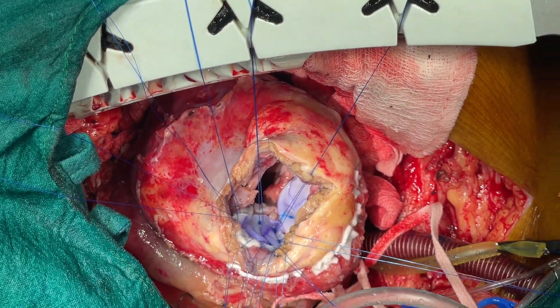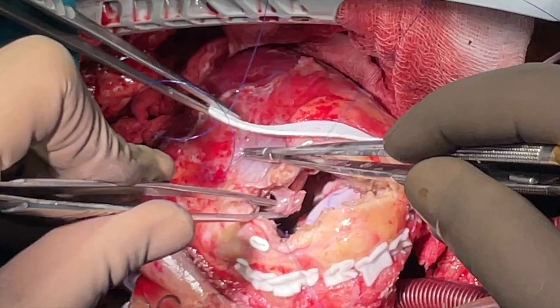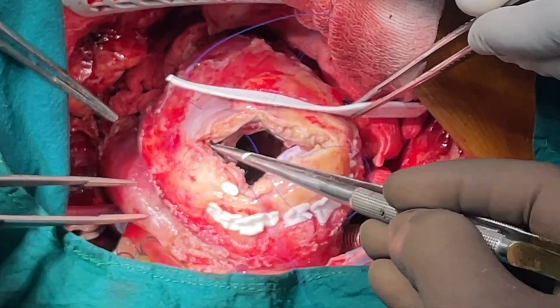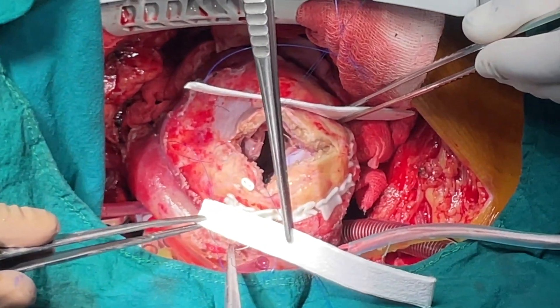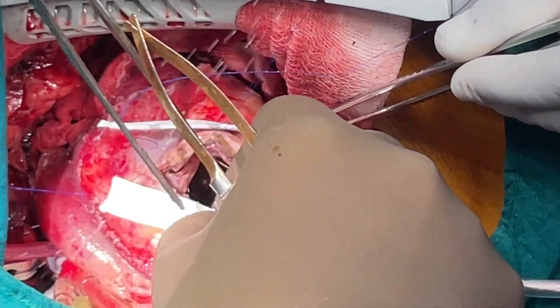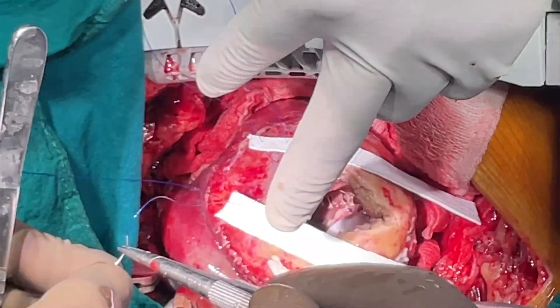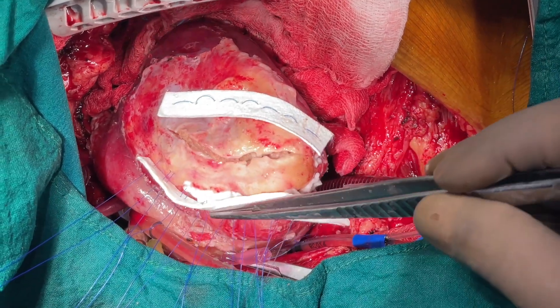We will now proceed with the closure of the ventriculotomy. The ventriculotomy is closed with 3-0 polypropylene interrupted mattress sutures on a 26mm needle. This is reinforced by PTFE hard felt strips on either side of the ventriculotomy. Be sure that all the suture throws are through healthy myocardium, which is usually a few centimeters away on either side of the ventriculotomy incision. Note that when these sutures are eventually tightened, the infarcted and non-viable myocardium is excluded.